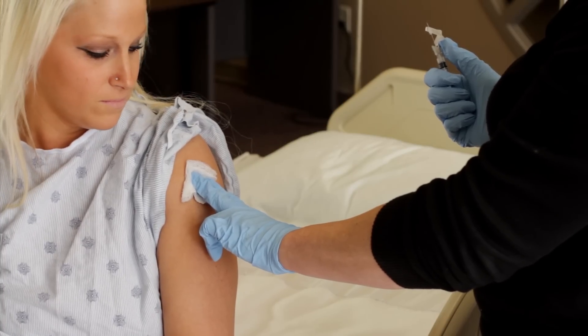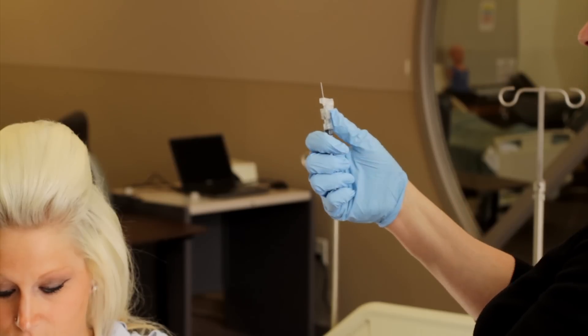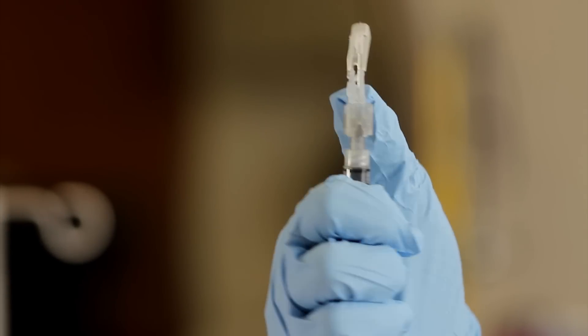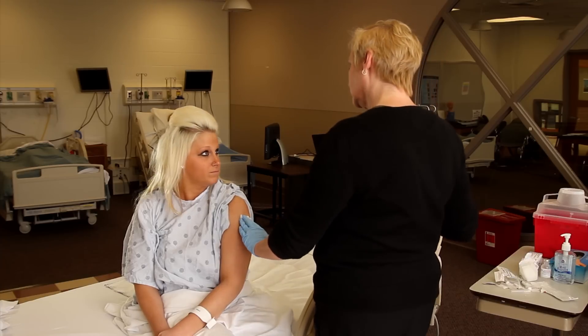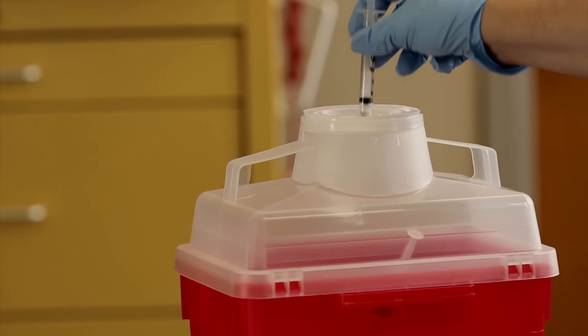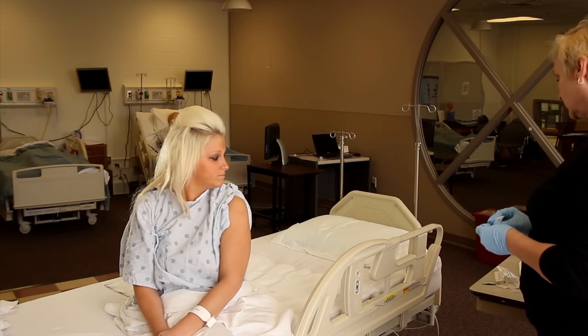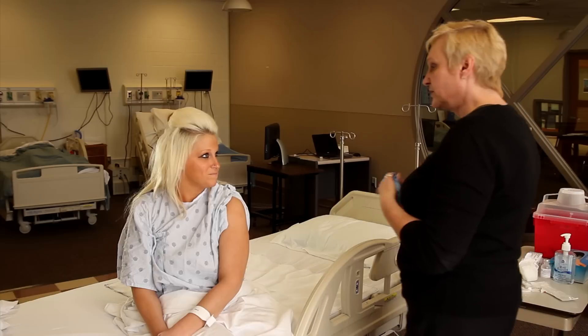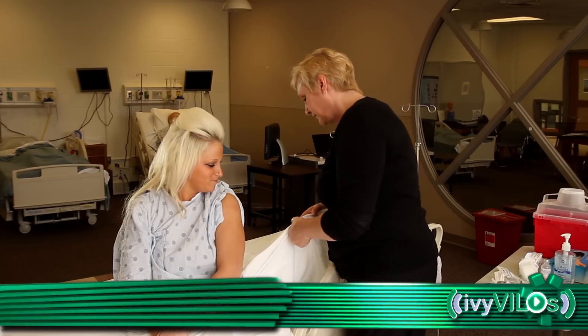Do not recap the used needle. Engage the safety shield or needle guard. Discard needle and syringe into appropriate receptacle. Remove gloves. Assess patient's response to medication.